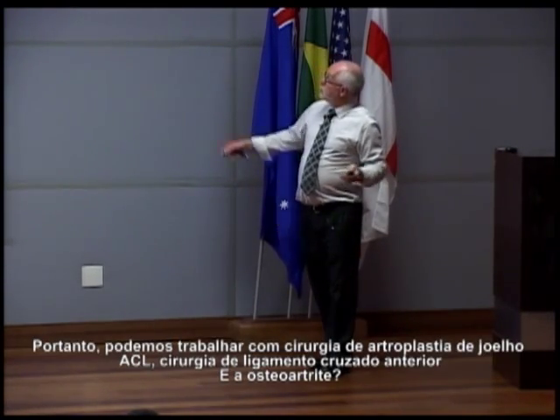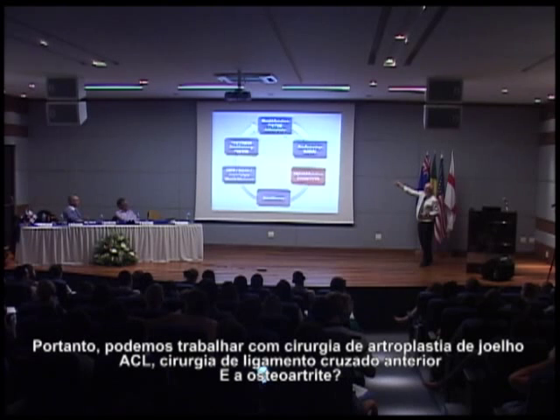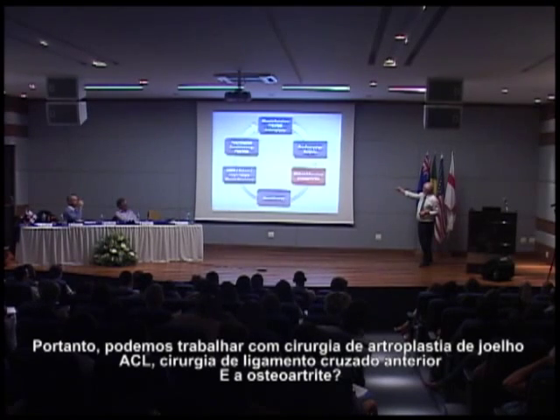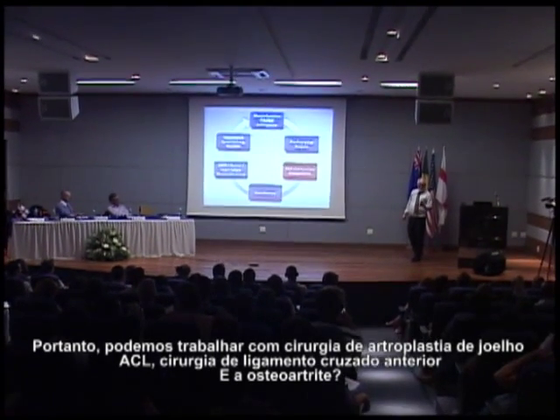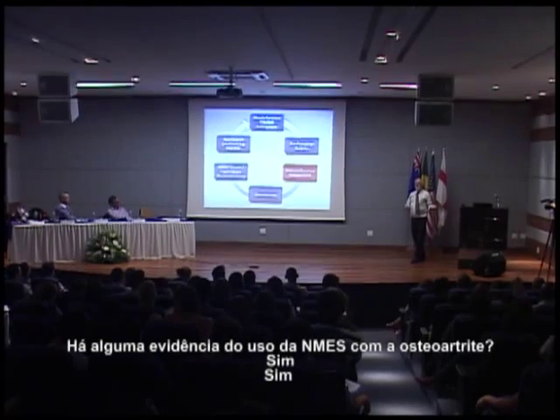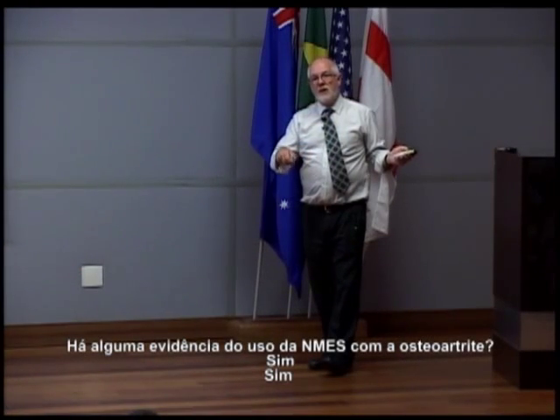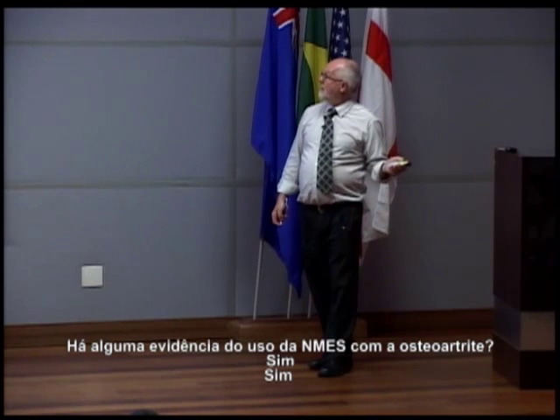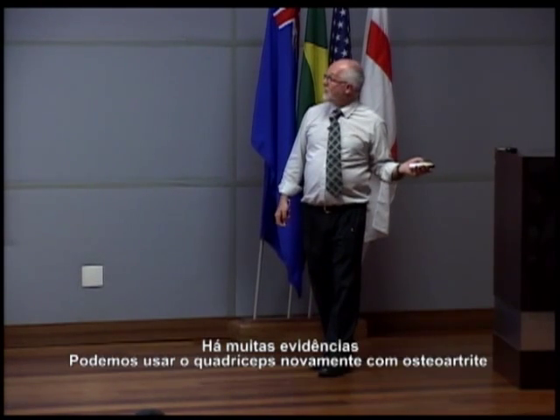Okay, so we can do knee replacement surgery, we can do ACL, anterior cruciate surgery. What about osteoarthritis? Is there any evidence for using NMES with osteoarthritis? Yes, there is. There's lots of it.